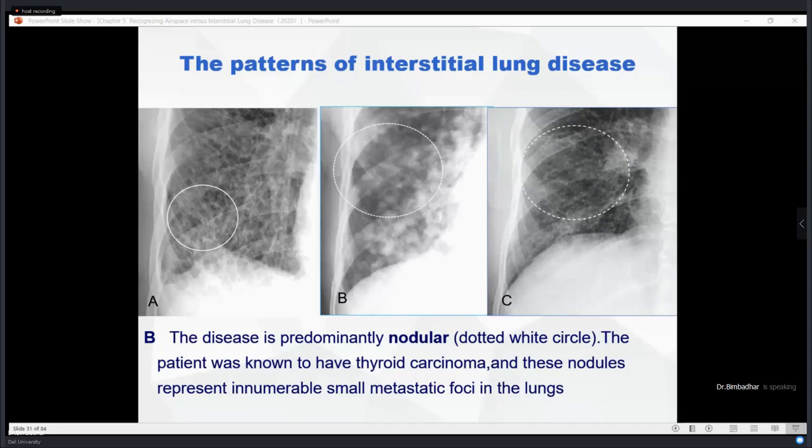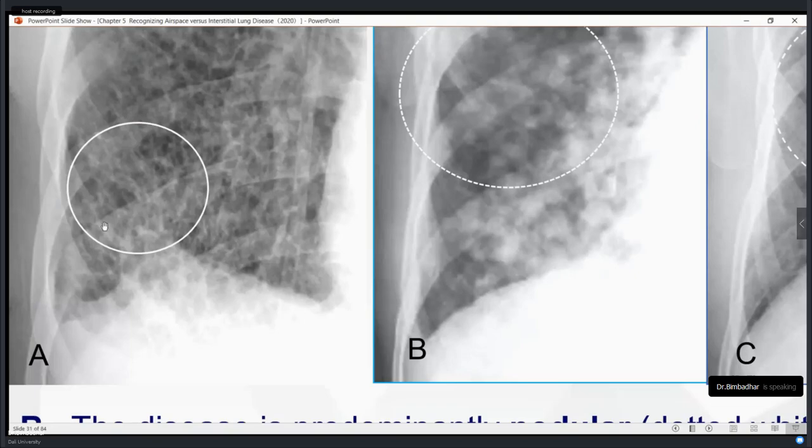Right. Okay, that is a very good question. Somebody was asking how we can differentiate the reticular pattern from the pulmonary markings on a CXR. Now, look closely here. A pulmonary marking usually has to follow a pattern where all the bronchi are going. It was a small anatomical fact that we know from before.